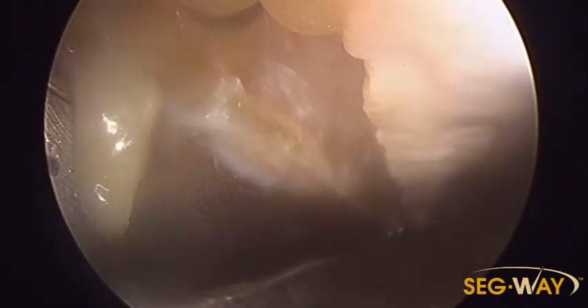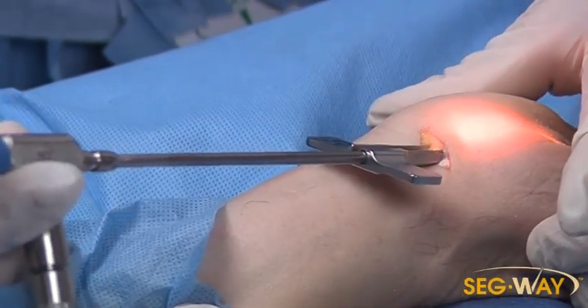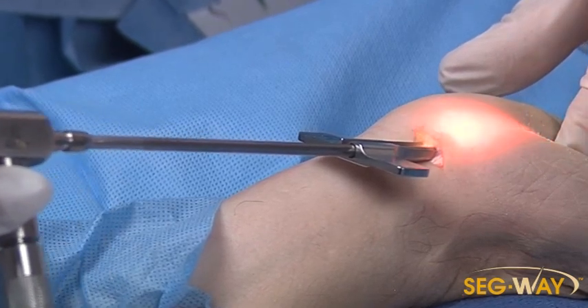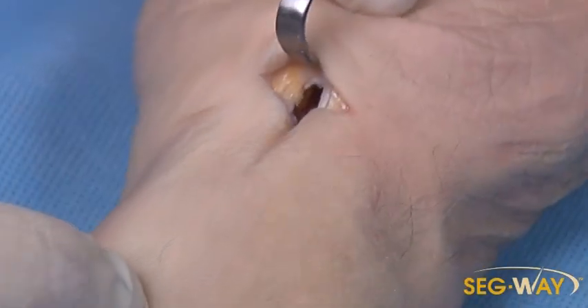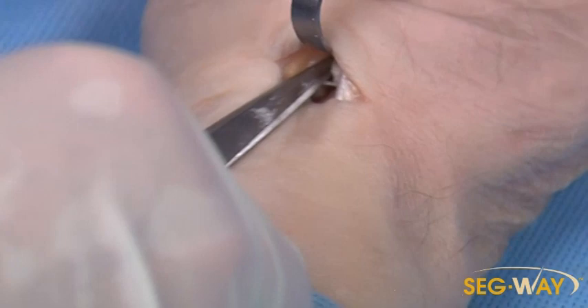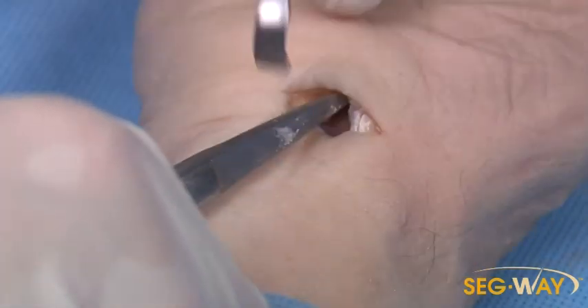There's really nothing there — it's all gone. The other thing you can see is the light coming through the hand, which we didn't see that well initially, so you know you've cut it. Take the guide out and get the scissors, then complete the connection between the two cuts, which is almost connected anyway. We cut it all the way — let's see the cut edge right there.